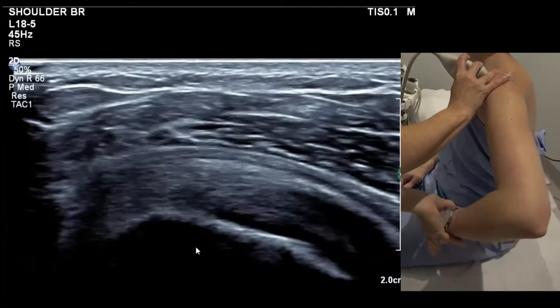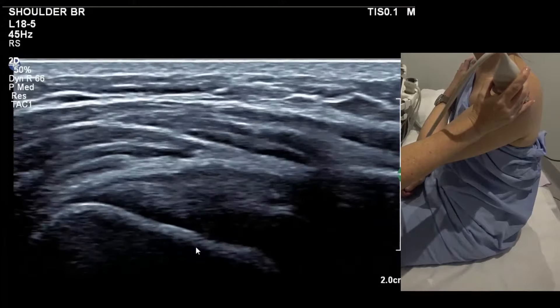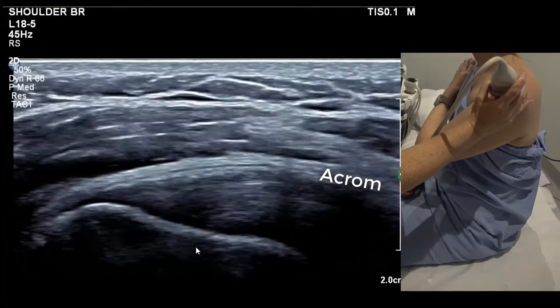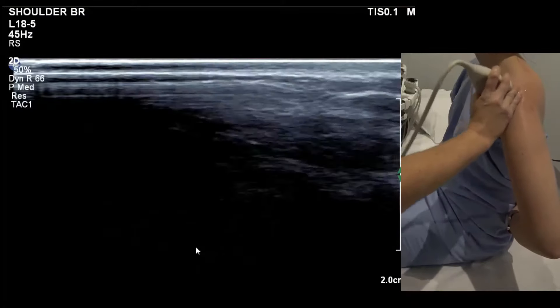Traditionally we used to take the arm across the chest, but you can see it makes infraspinatus slightly hypoechoic and half the tendon hides under the acromion. We try to avoid that position now because it distorts the tendon.